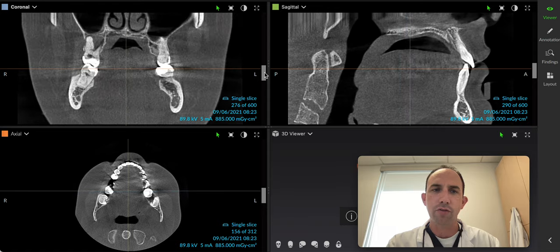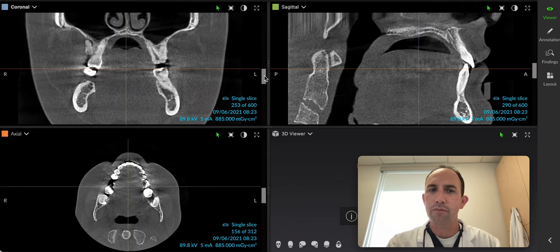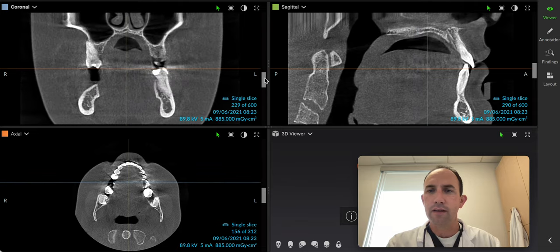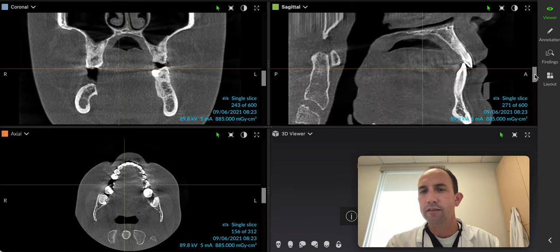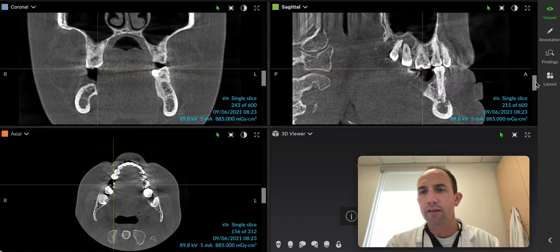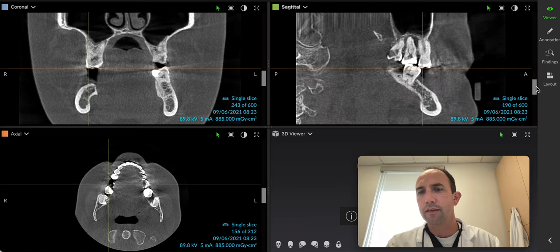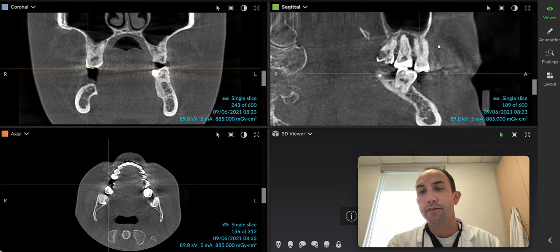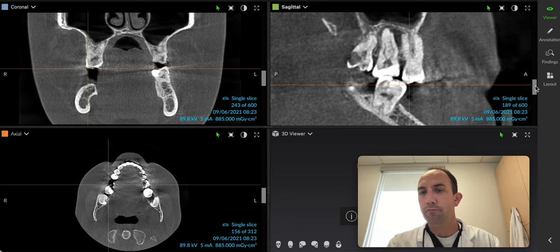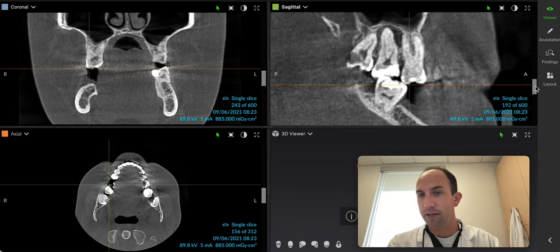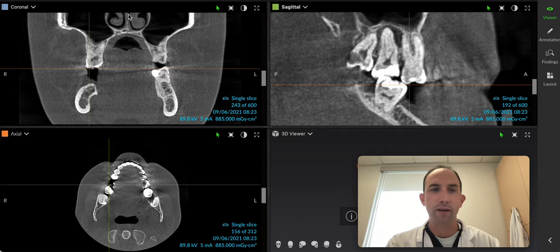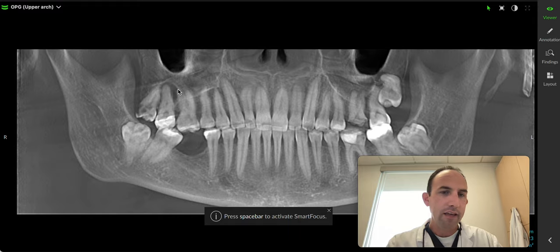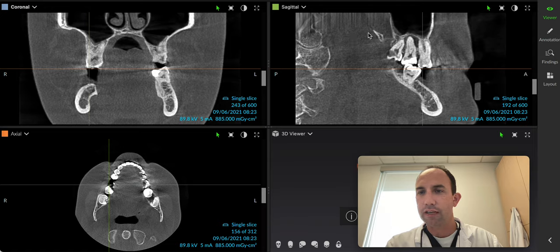Does it affect number three at all? I think it probably does. If we go to the sagittal slicing here — look at that — it's including the distal root of tooth number three. Going back to compare the 3D panoramic to the 3D, it looks like we have three teeth that are connected in this abscess. Let's go back to the panoramic. Yes, there's some connection here, but it's not nearly as clear in the 3D imaging.